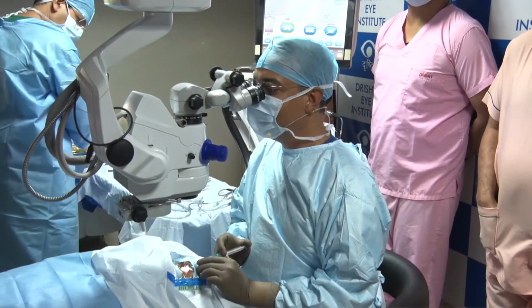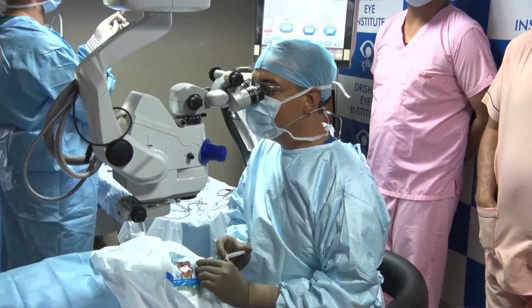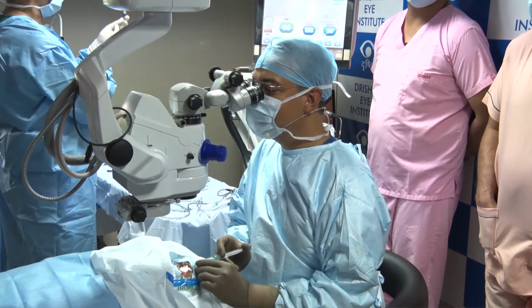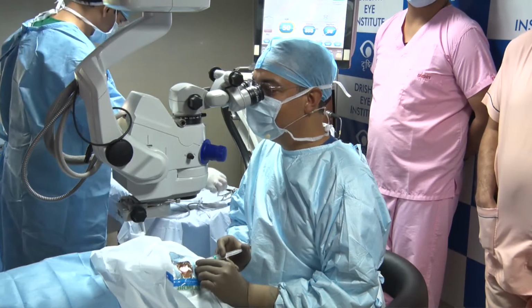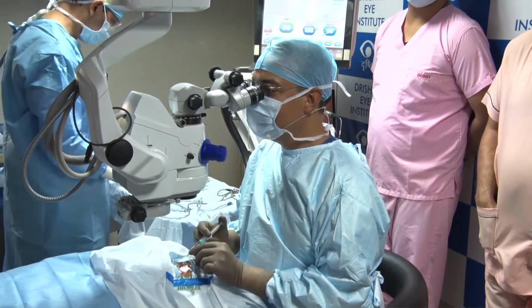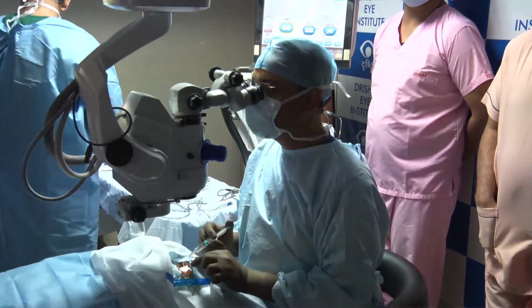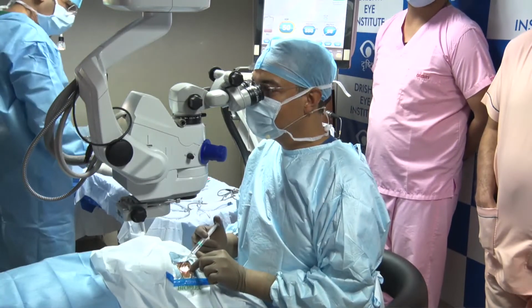But with the IPCL, the refractive results have been extremely good. I'm very happy, and the vault and all calculation is good. Using the white to white, the surprises are very rare. It's not common to get a surprise actually. So that's one good thing, and it's a relief to have that. Yeah, you get customized also with the IPCL.